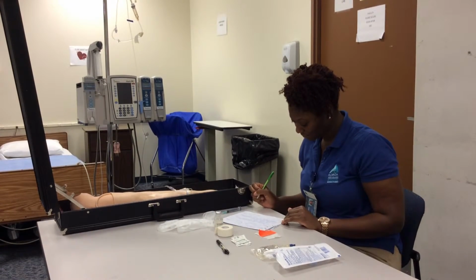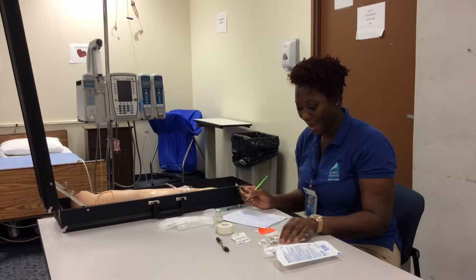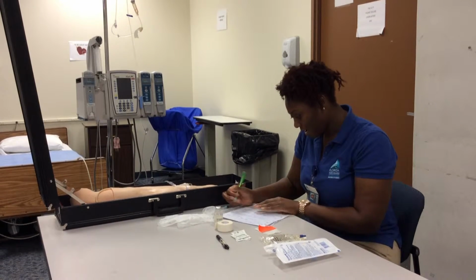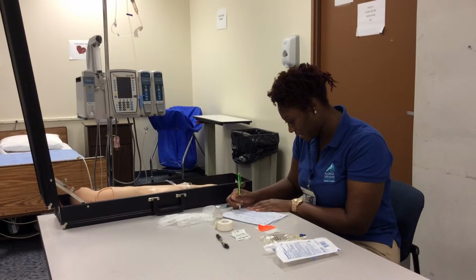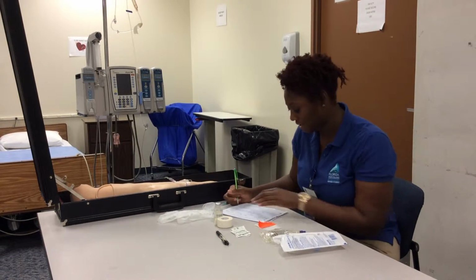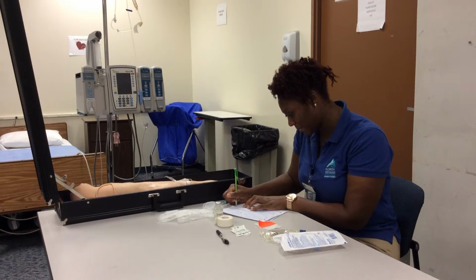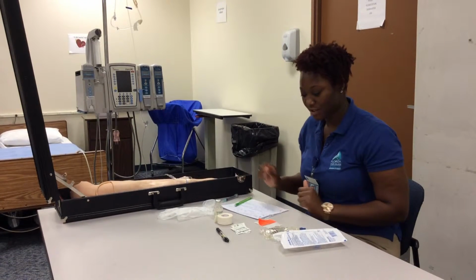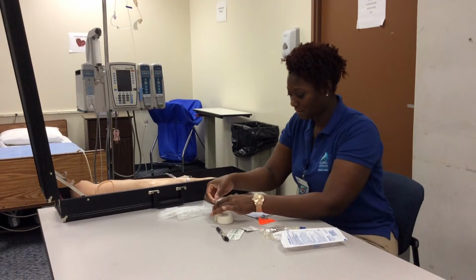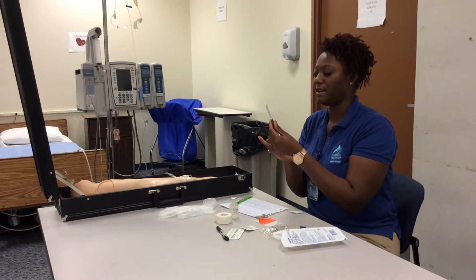Alrighty. So now I'm going to be doing the IV fluids. I have a 50 mL bag. The infusion time is 15 minutes, and my tubing has a 10 drop factor, which equals 33 drops per minute. Alright, so now I'm ready to draw up my medication. 0.5.